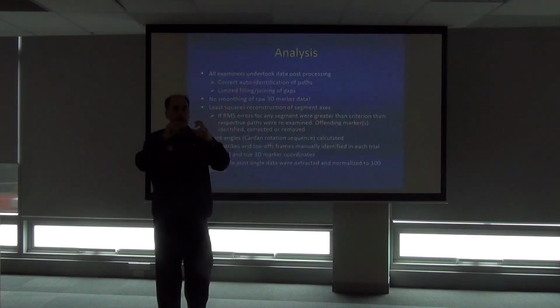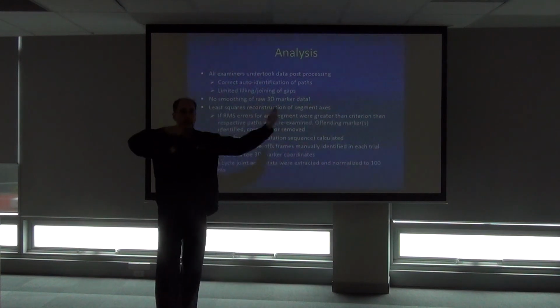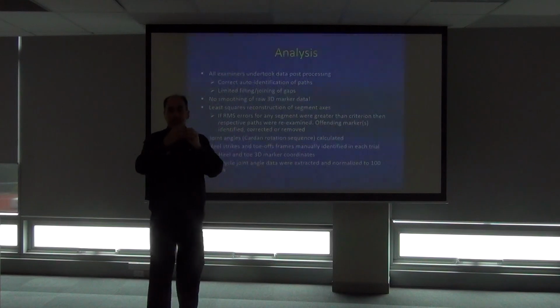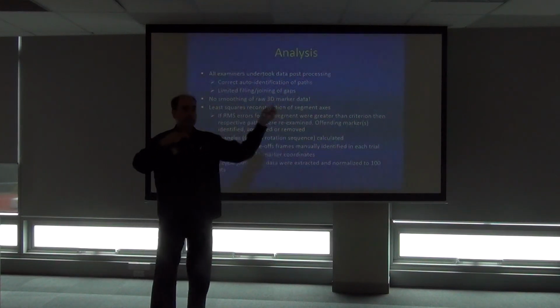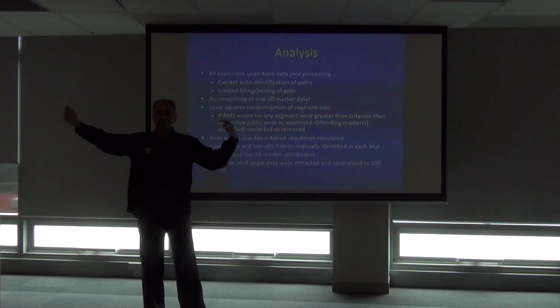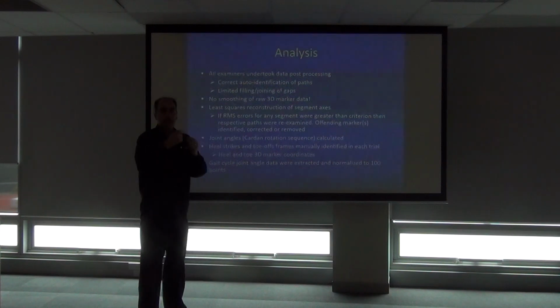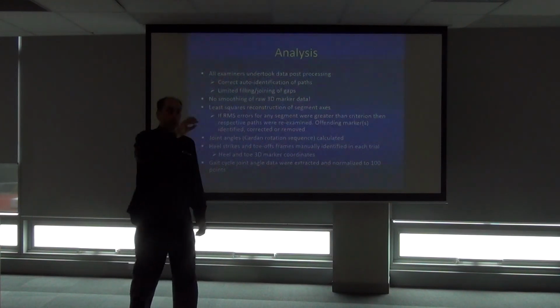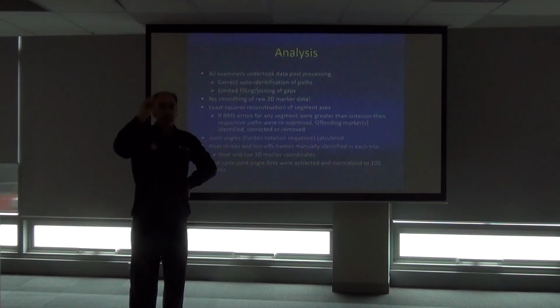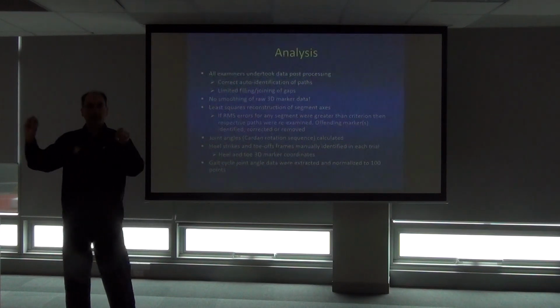It could be you get things like ghost markers that have been reconstructed from cameras, a marker that doesn't actually really exist. Those camera rays actually belong to another marker that's been misconstructed, and some rays have intersected, and you get phantom markers floating around. It may have jumped to a phantom marker, or it may be the marker was visible in 3 cameras, it dropped to 2 cameras and there was a jump. Came back into 3 cameras again and there was a jump back to where it should be.